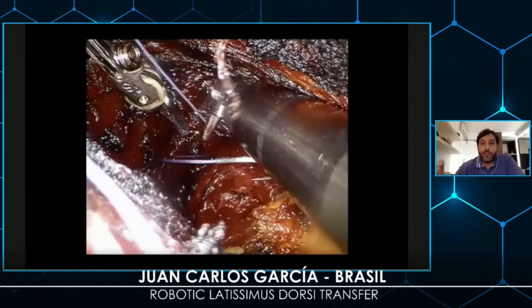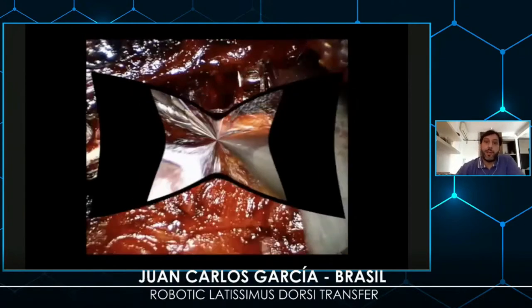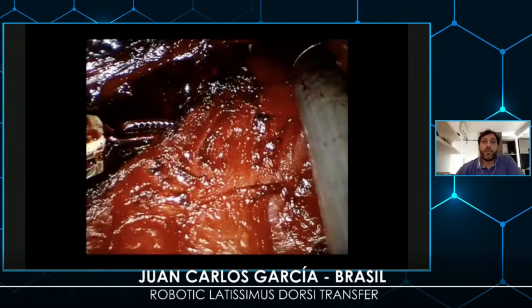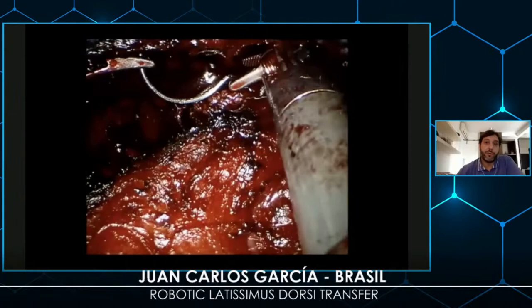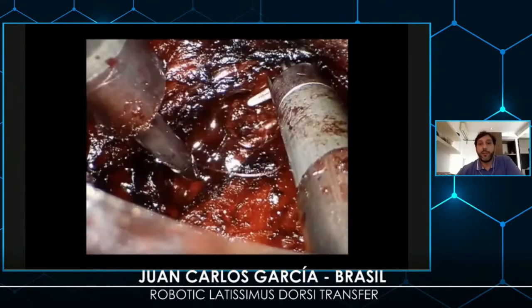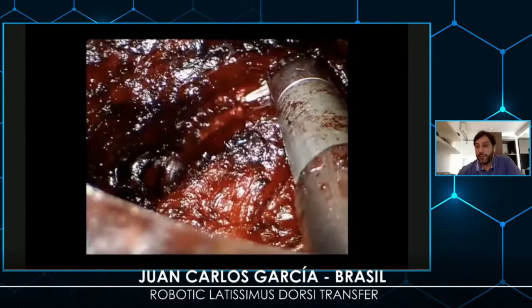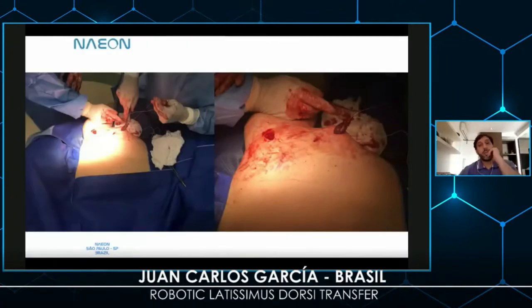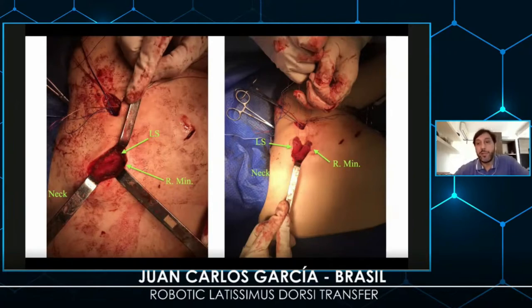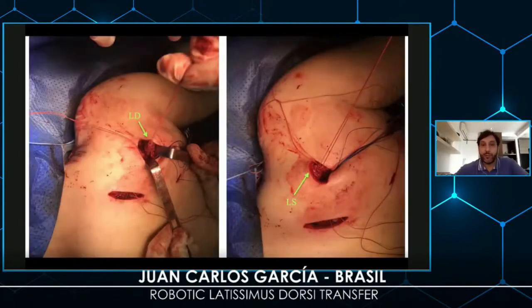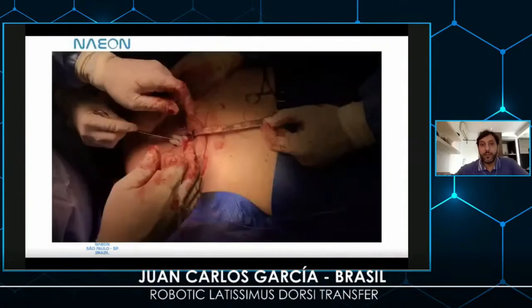This is the quadrangular space — don't go there, but just to show you how it looks. Then we start to make some sutures inside the body; these sutures are important to pull the latissimus dorsi out of the body through the portal — the optics portal. I take the wire, put the latissimus dorsi out, then pass it subcutaneously. There is a small opening on the scapular spine; the levator scapula and the rhomboid minor are also passed subcutaneously through this small opening in the scapular spine and always sutured. Here are the final sutures.